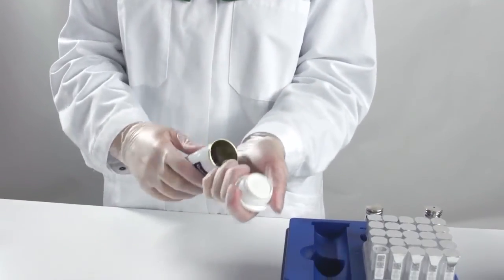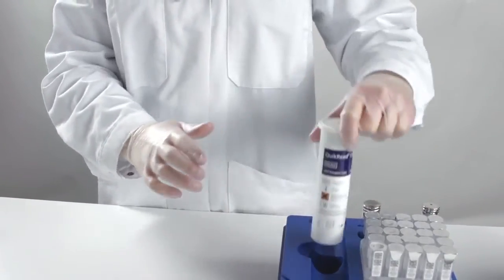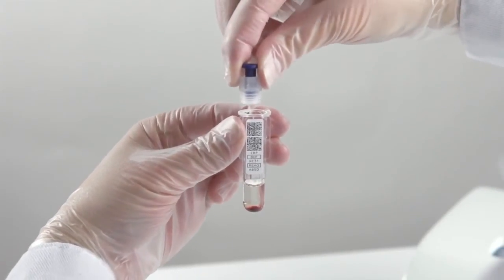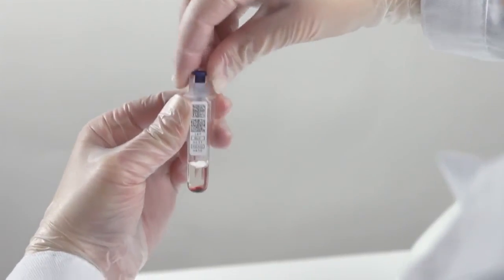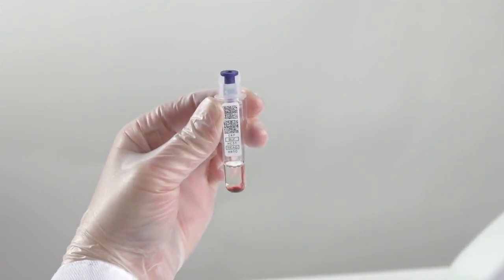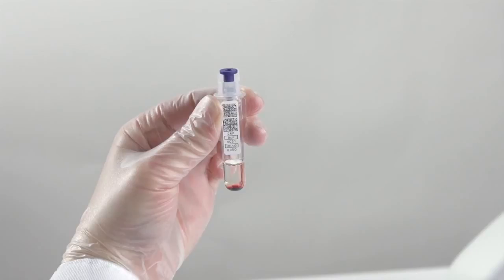Take one cap out from the reagent cap tube and close the tube. Hold the cuvette from the sides and put the cap on tightly. Alternatively, the cap can be put on when the cuvette is in the rack. The cap is in the right position when the threads are not visible. Take care not to push in the inner blue part of the cap.